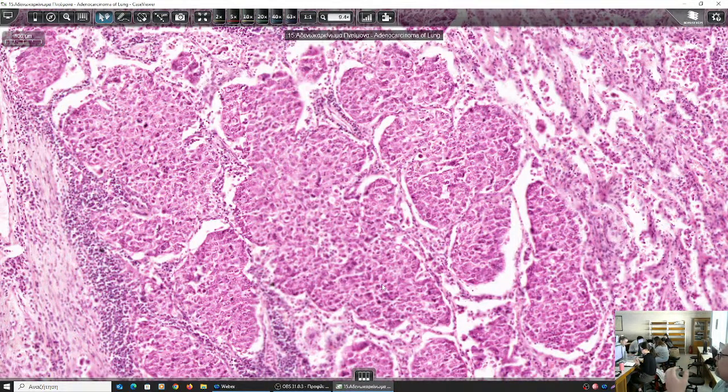What does this mean? If a carcinoma is high grade, we never know if it is in the present site as primary or metastatic, and we should look sometimes with extra stains, specific methods, to identify the derivation of these cells. So now that we have seen in other areas that it was an adenocarcinoma, we can say that this is a high-grade component, a component of poor differentiation of the adenocarcinoma.